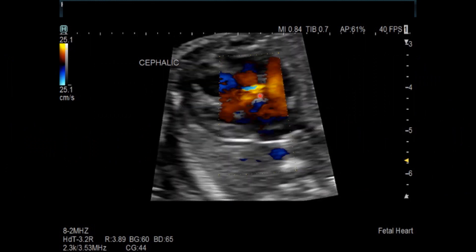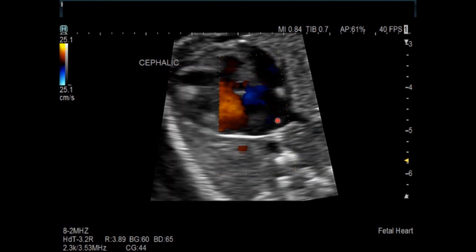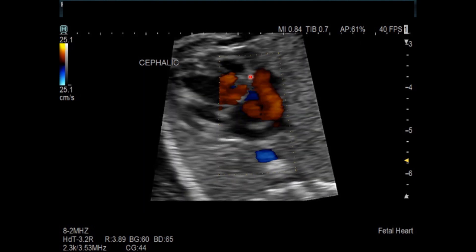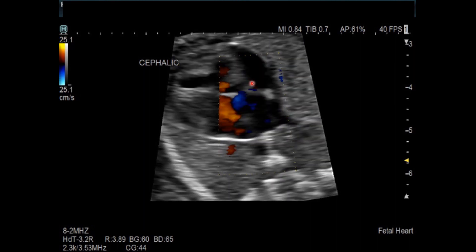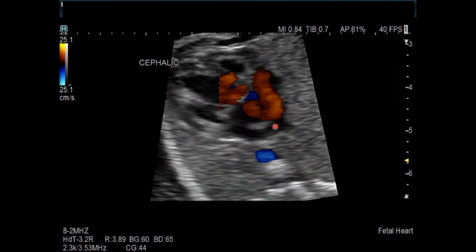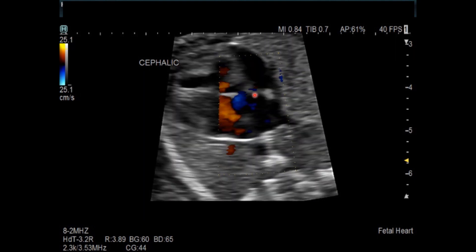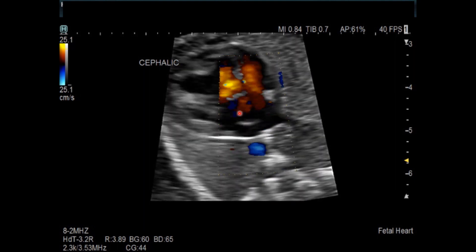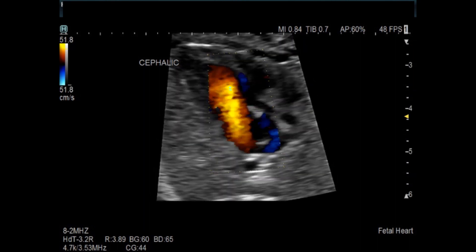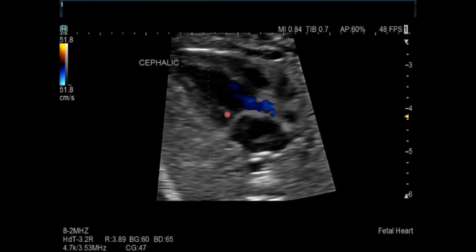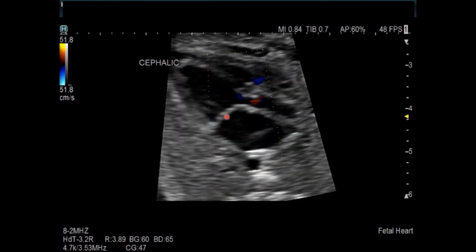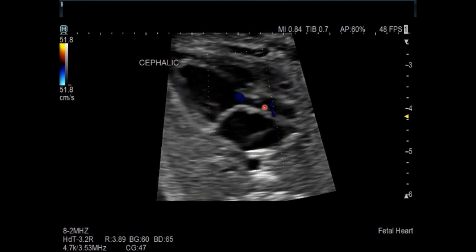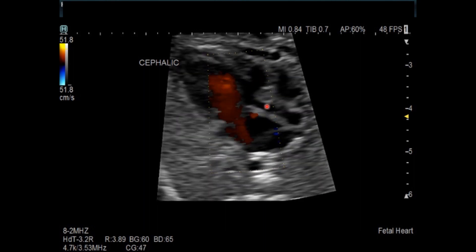Looking at the intraatrial shunting, it is mostly blue — which makes sense because of tricuspid valve atresia. Any blood coming into the right atrium from the SVC and IVC needs to shunt across the foramen ovale, because there is no egress from this chamber. It needs to get out to the left side of the heart. Color Doppler shows nice laminar mitral valve inflow and laminar antegrade flow in the subpulmonary region.